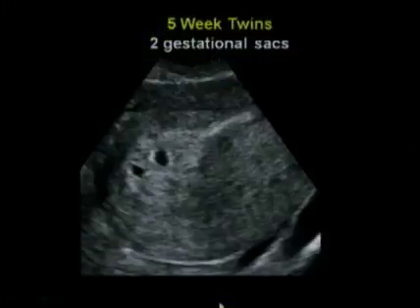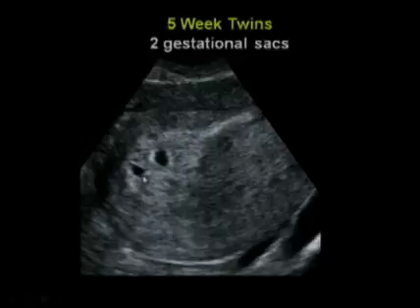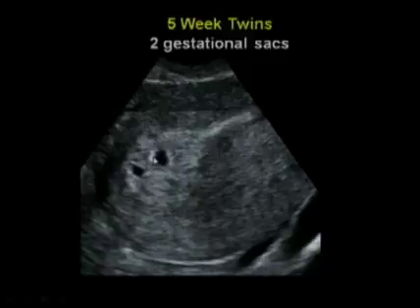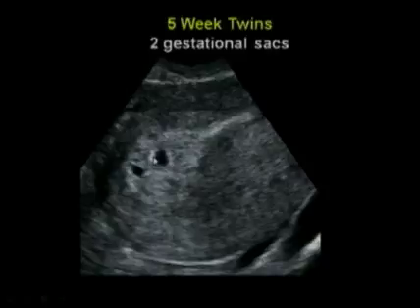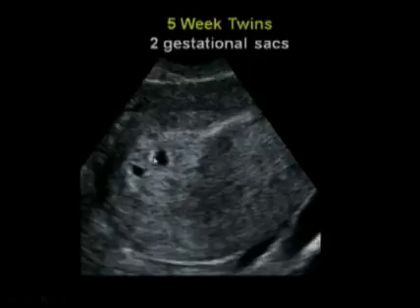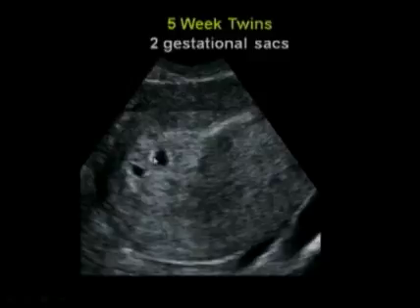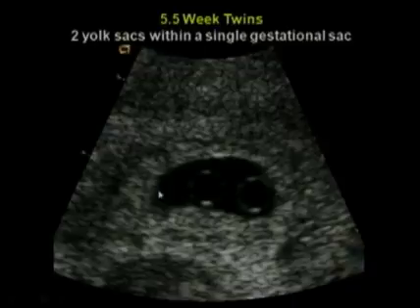Here is a five-week transvaginal scan. We're seeing two fluid collections surrounded by a bright ring — two gestational sacs. We can tell the parents that, as far as we can tell, she's having twins. We can't be sure there won't be a vanishing twin, and as we'll see, we can't be sure there won't be more. But our best estimate is that this woman is going to have twins.